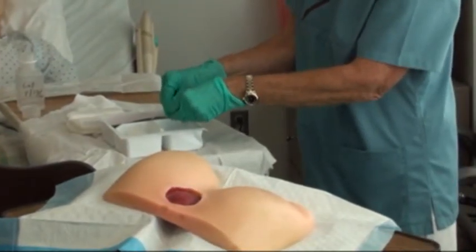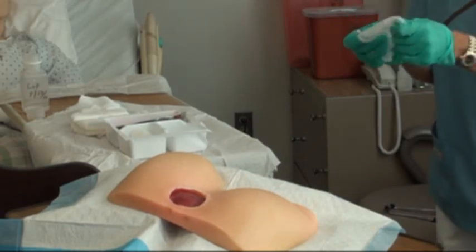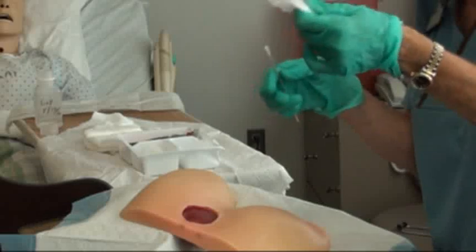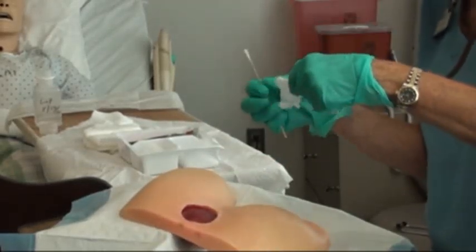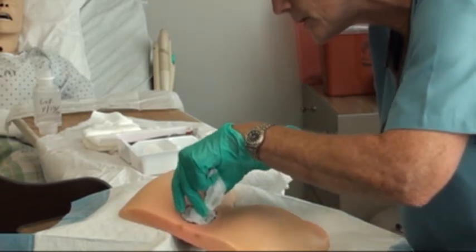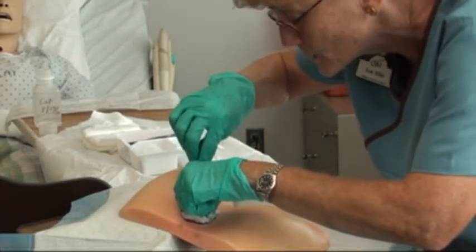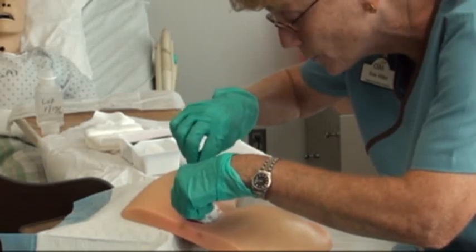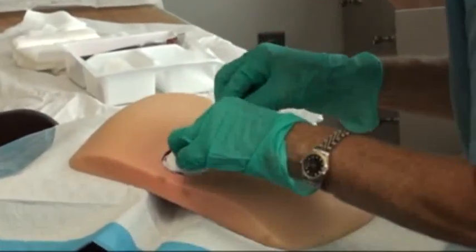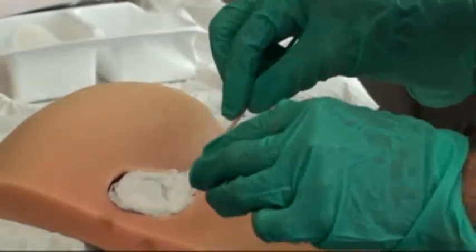I'm going to reach in, squeeze the excess saline out — I don't want to hover over my field, so that's why I've stepped over the garbage can. Now fluff this out. You can either use the Q-tip or some people use their fingers. Keep the gauze in your hand because if it drags on the skin, it's contaminated and we'll have to start over. Go ahead and pack this in, up underneath the edge. You want to make sure not to pack it too tight, but get it up underneath enough to cover the part that may abscess if it starts healing from the top instead of the bottom out. Also, you don't want a high dressing that creates a big lump, because it puts pressure on the wound bed. Be careful using the Q-tip — if the patient jumps, you could poke them unintentionally. Now that's all in.